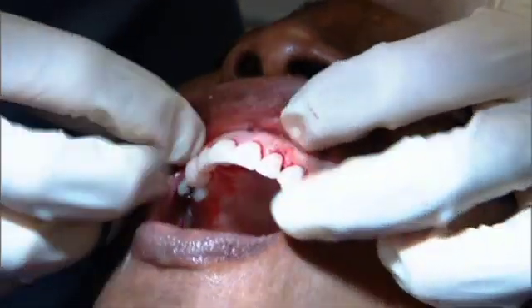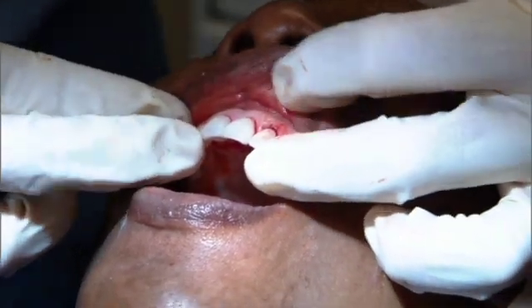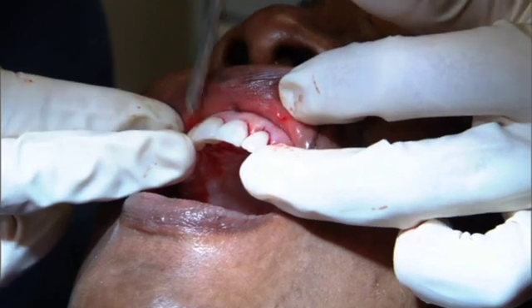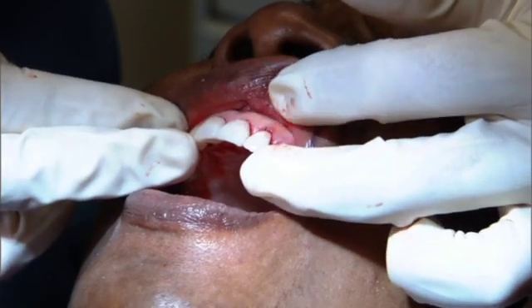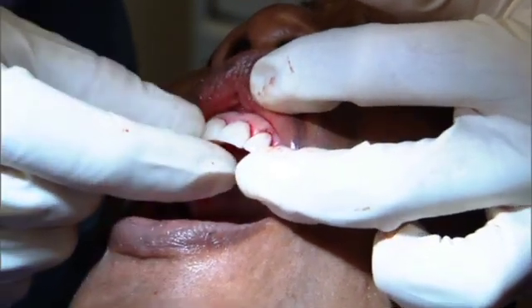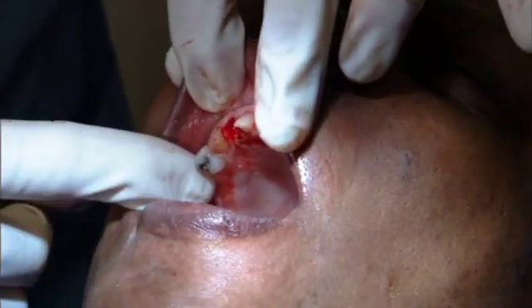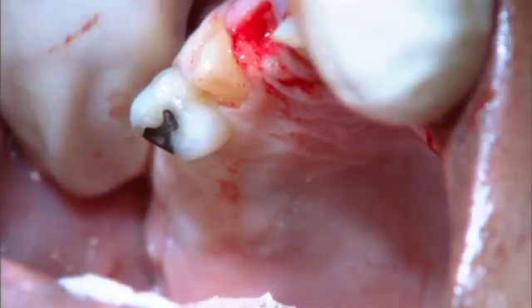We've gotten the other side grafted, and as you can see, we did the same thing, keyhole, and we've made it so that our pontic will support the hard and soft tissues. The next step, what we would like to do today, is go ahead and get these bicuspids out. We'll slip this number 5 out.